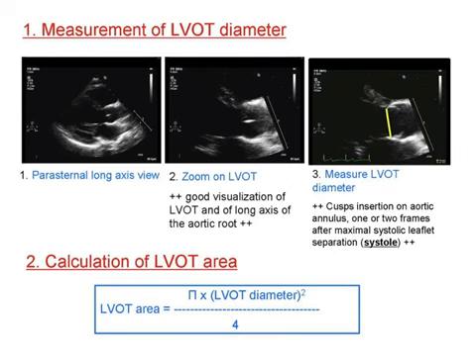So to measure the cardiac output, the first thing you do is measure the diameter of the left ventricular outflow tract. And you can see that in the parasternal long axis. So first thing you do is go back to parasternal long. Remember that? That's the RV up here, the LV over here, the LA is here, the mitral valve is right here, and then the blood comes in this LA, LV, and it gets pumped out this aortic outflow tract.